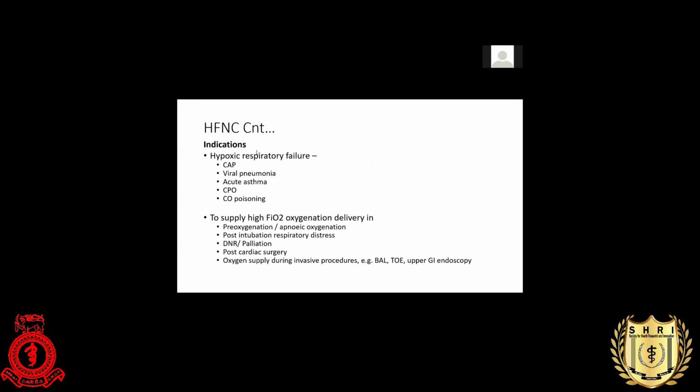What are the other indications than treating COVID pneumonia? These are the indications, mainly hypoxic respiratory failure associated with community acquired pneumonia, other viral pneumonia, acute asthma, CO poisoning, carbon monoxide poisoning. And also you can use high flow nasal cannula to supply high FiO2 oxygenation in situations like pre-oxygenation, apneic oxygenation, and to prevent post-intubation distress.